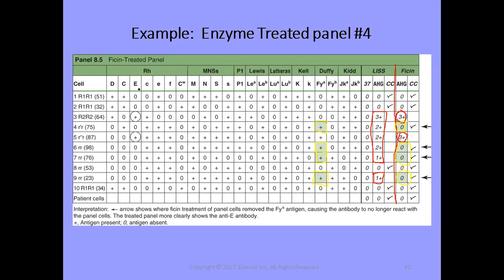Oftentimes, following enzyme treatment, remember RH antigen reactions can be enhanced. Sometimes you might even see stronger reactions when you're using the enzyme-treated cells, not necessarily here, but that can happen.